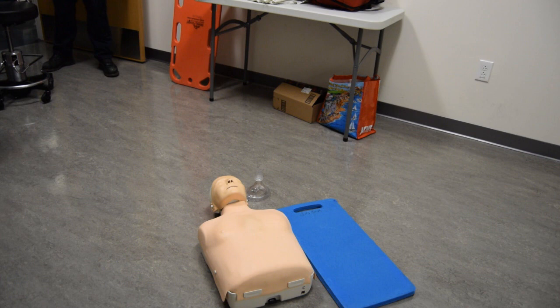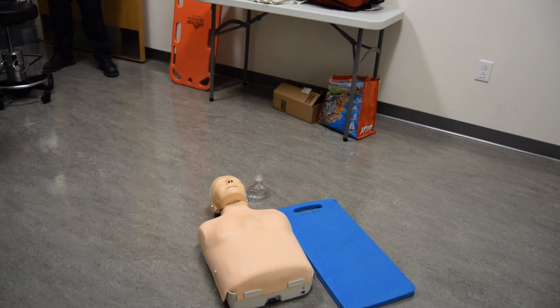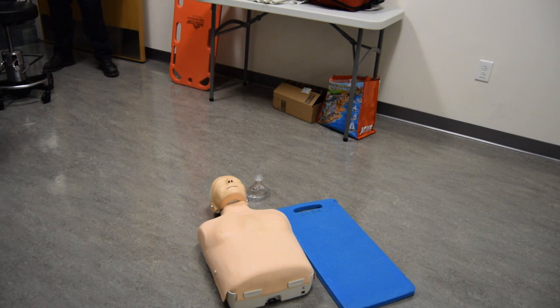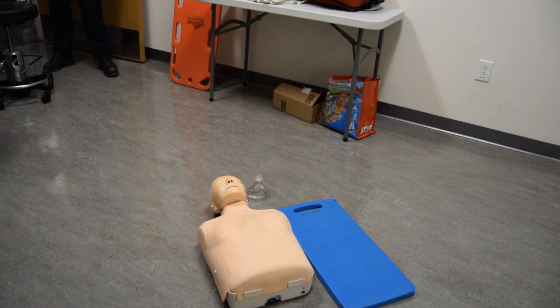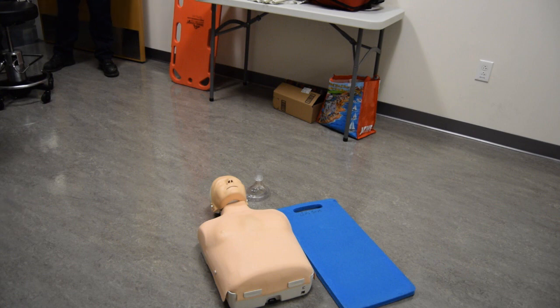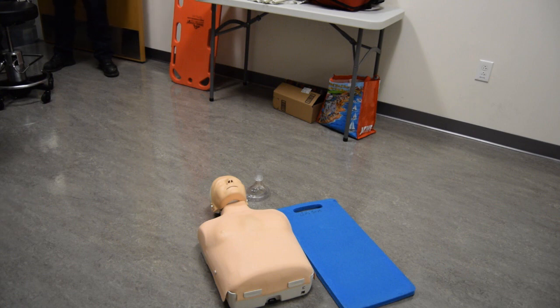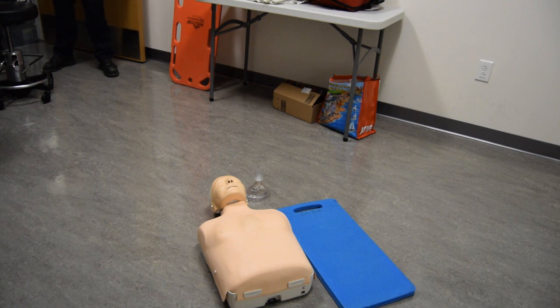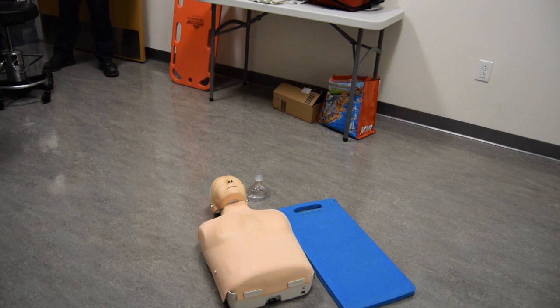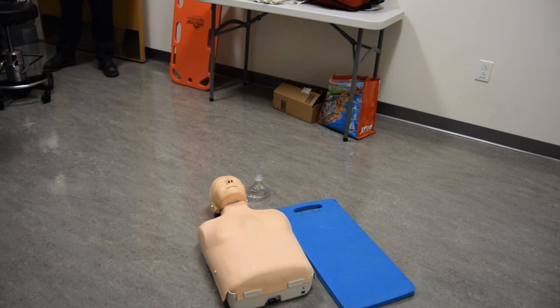If you brought your own AED, I need to make sure it is approved for testing before we begin. You will have 10 minutes to complete this skill once we begin. I may ask questions for clarification and will acknowledge the treatments you indicate are necessary. Do you have any questions?